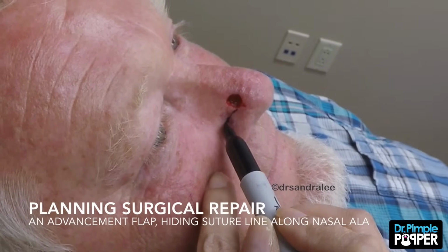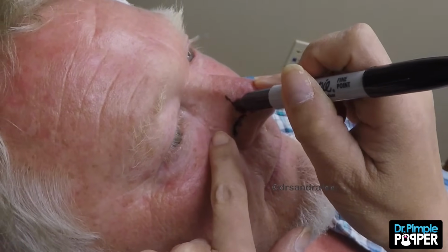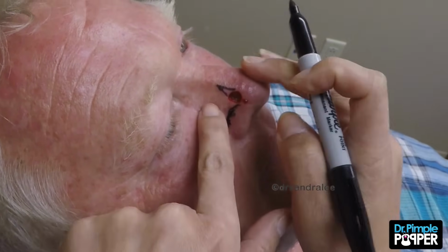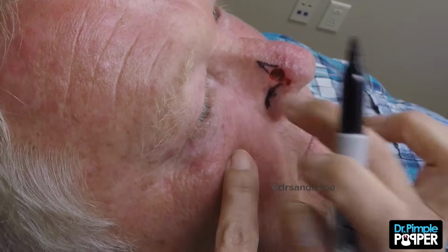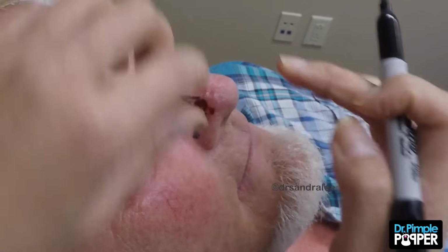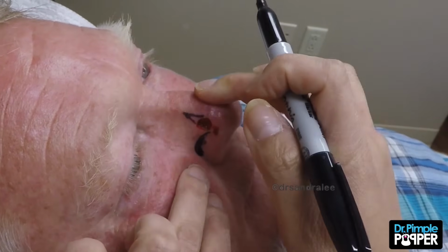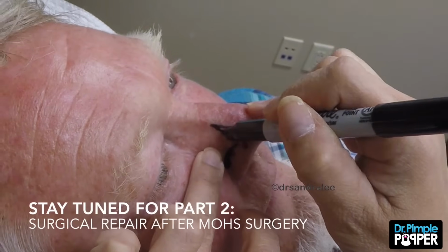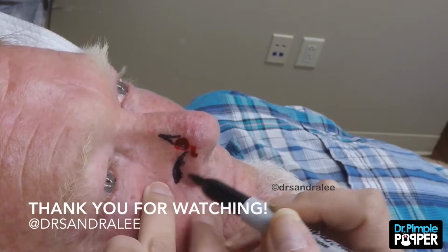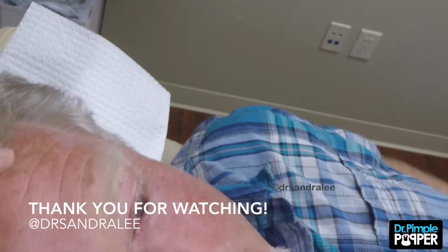So we're going to try to hide this in your normal creases in your nose, like here's your nasal crease. We're going to use a 4 and 6. We're going to move this tissue, taking a little bit of tissue right here, and probably making an incision right along your nasal crease to pull this tissue closer. You have a mole or a keratosis next to it. I'm going to take that off too. Since we're moving this tissue, this is where there's more movement, so I have to take that into account, and we're going to need to take a little extra right here to be able to move this over here. Like that. So this is going to move like this. We're going to move a little bit onto your cheek here, because we're going to try to shift this tissue a little bit closer. Sounds fun. Your nasal sidewall's good for that, okay?